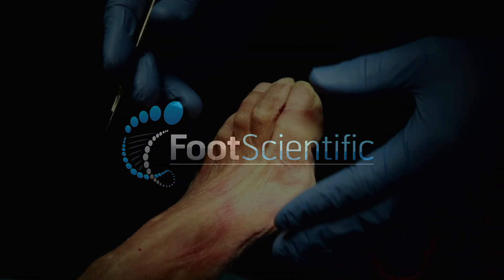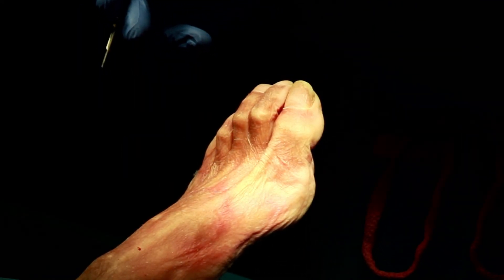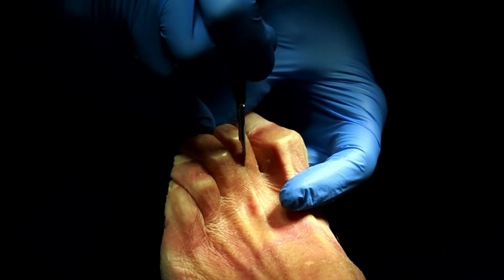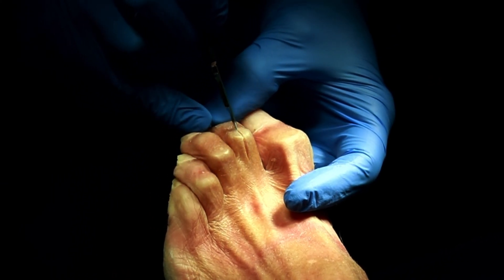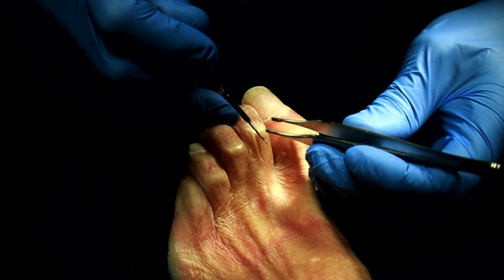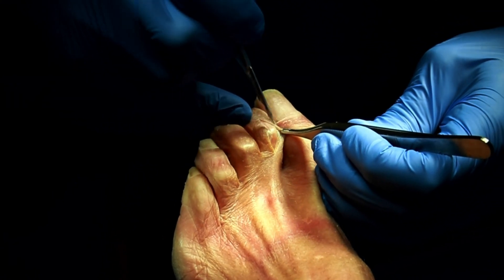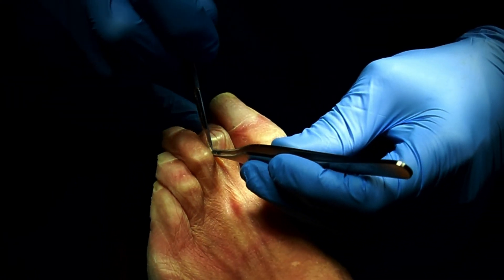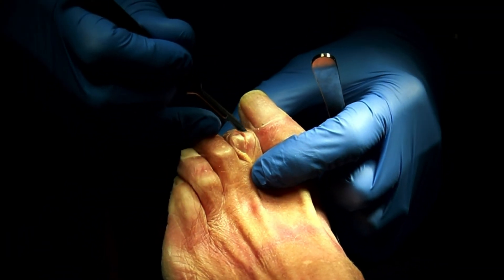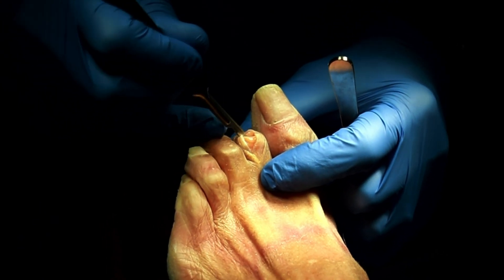I wanted to demonstrate the simplicity of this procedure and the use of a K-wire as a pre-drill. The key is a longitudinal incision because it's extensile, so you can extend it a little bit. I'm going to make it a little longer since I'm by myself without an assistant. The first step is creating a small opening around the edges for tissue release, and then a transverse incision to open up the joint.